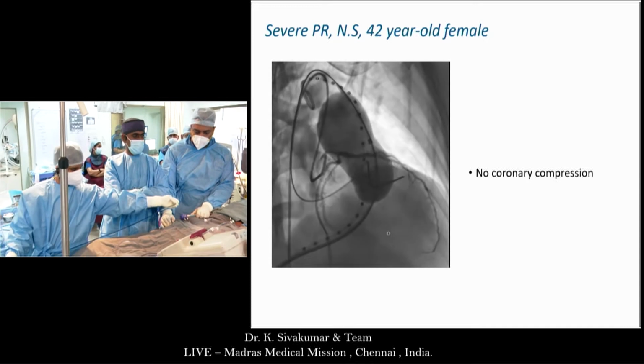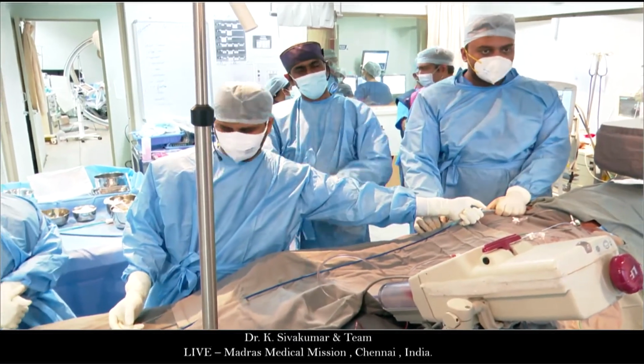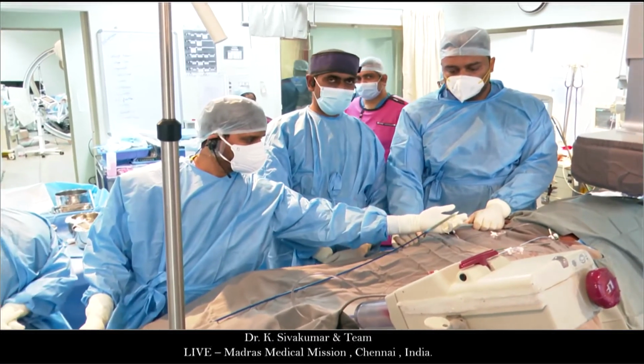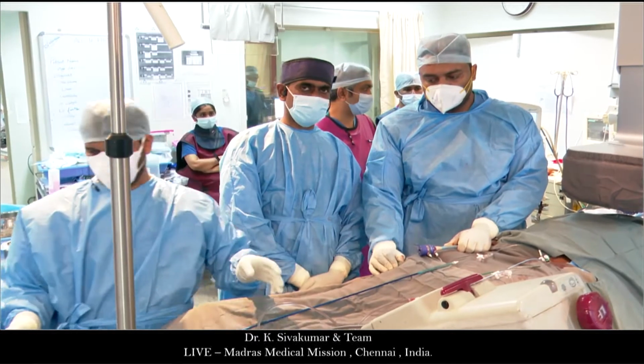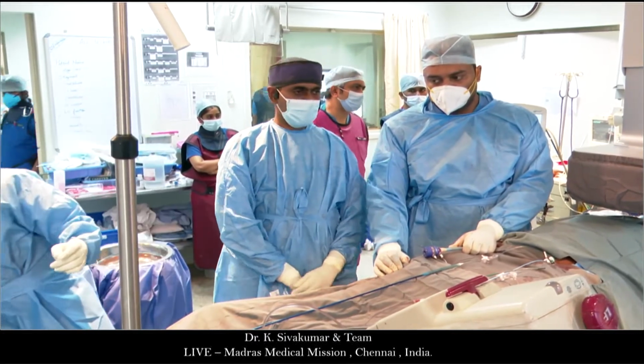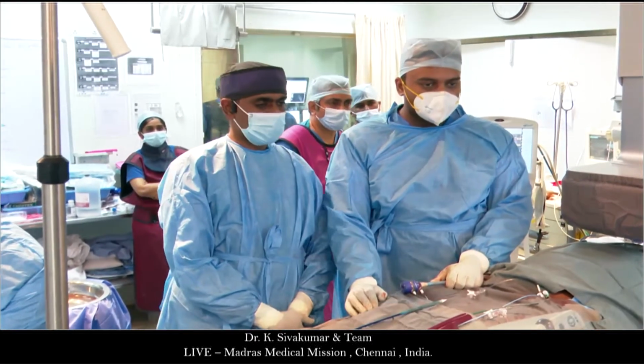There is no coronary compression. If you look at all the volumes, all the diameters, the narrowest point was 32, but in a few areas it was 34 to 36. I'll show you some more angiogram. Next PowerPoint picture.